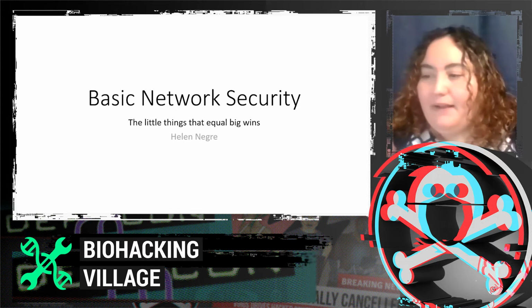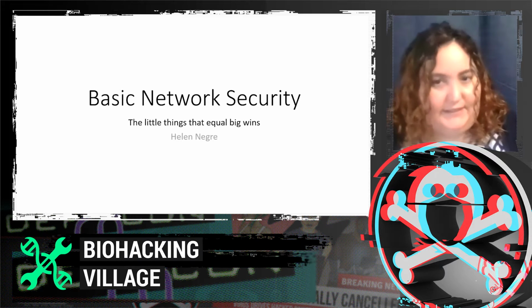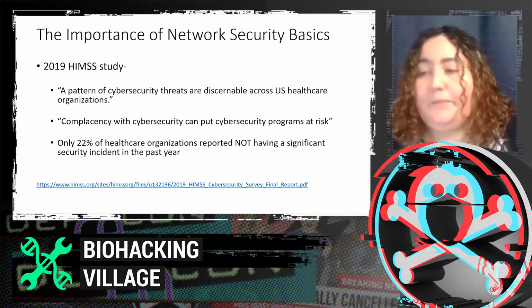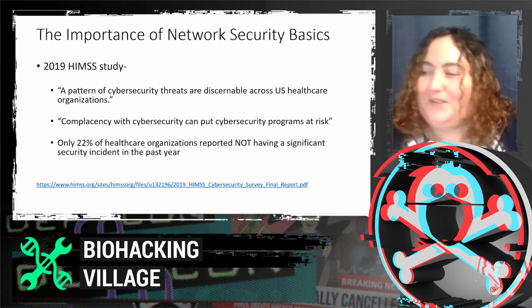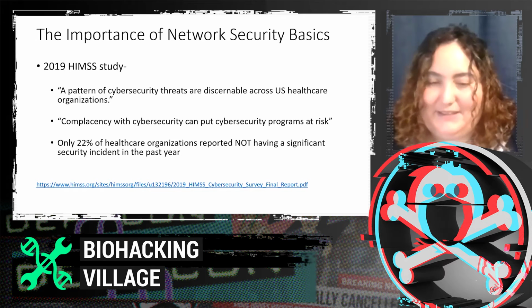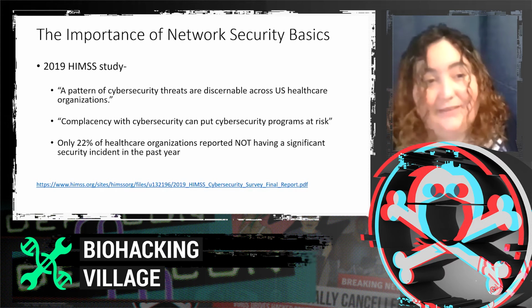We're going to start with the little parts of network security, cyber hygiene, and just the basics. As Matt said, the 2019 HIMSS study shows the importance of the network security basics. A pattern of cybersecurity threats are discernible across U.S. healthcare organizations, and as Matt has just said, the trend has only increased in the current pandemic era.